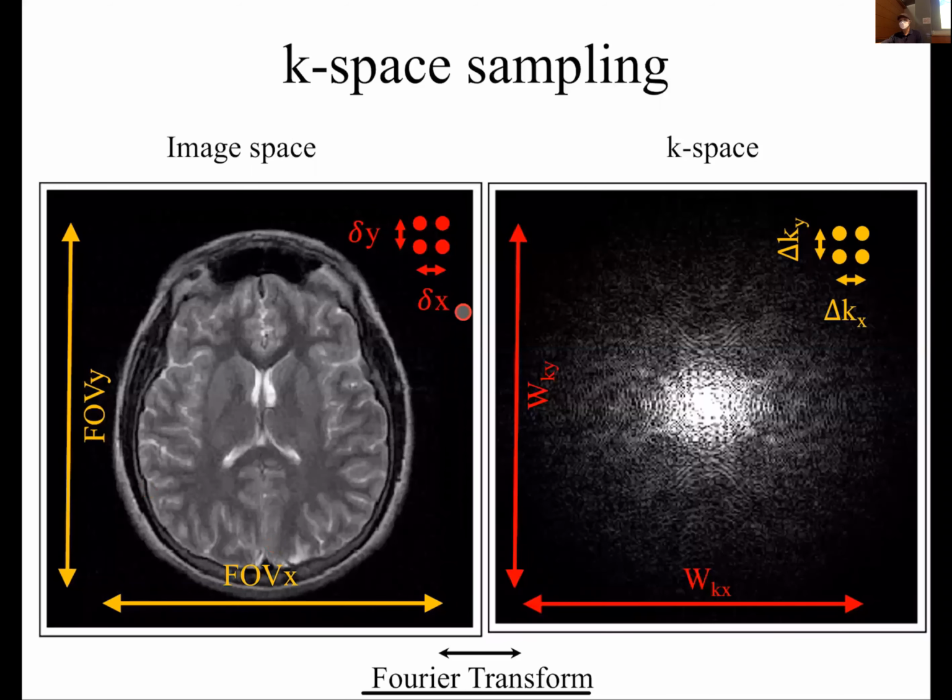They're also going to specify the resolution, basically how small they want each voxel to be. If you're scanning a human brain, a typical FOV will be about 24 by 24 centimeters. That covers most human brains. And a standard resolution for anatomical imaging is about 1 millimeter isotropic.